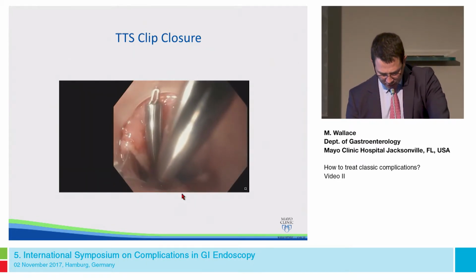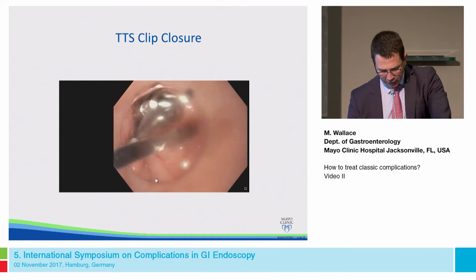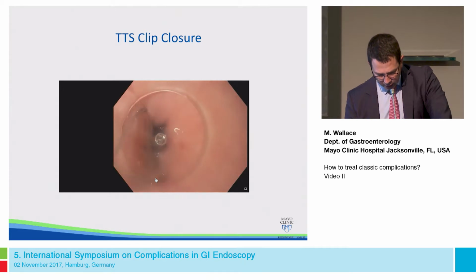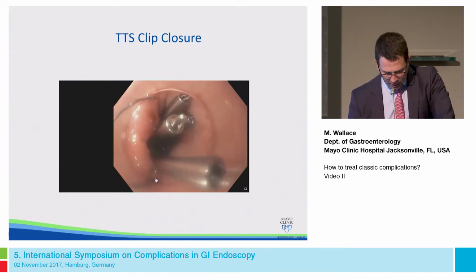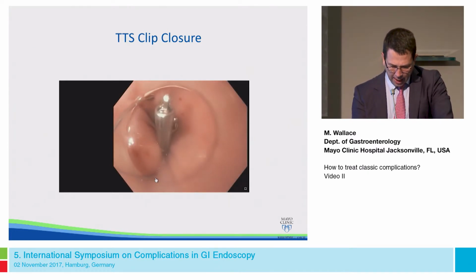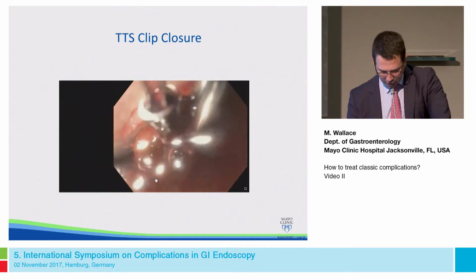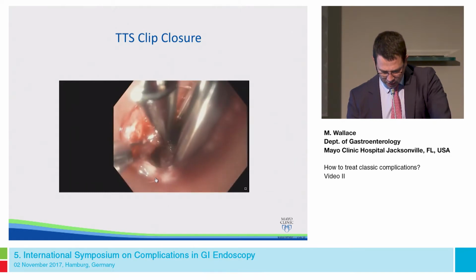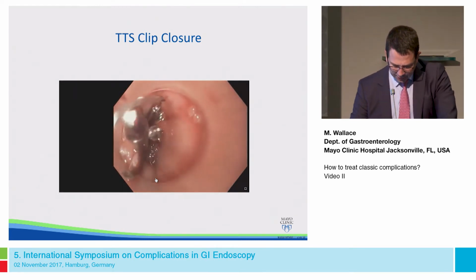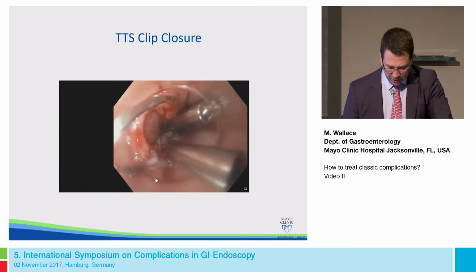And you can actually see this one here is quite difficult. This one we actually did misdeploy on one side of the lesion, and I was quite worried that we would not then be able to get secure closure, but fortunately the next clip we did get just above that. But it's quite important, and you can see we're using the cap to suction a little bit and also using the cap to push the other clips a little bit to the side. It can be a little bit difficult here. Watch the top end of that clip. That's going to slip off repeatedly, and we keep closing, making sure that we have it, but it did slip away. But fortunately, the next clip above it did hold.